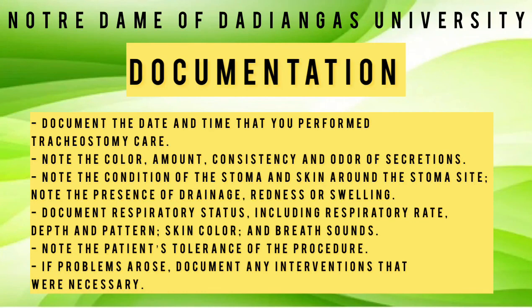For the documentation, document the date and time that you performed tracheostomy care. Note the color, amount, consistency, and odor of secretions. Note the condition of the stoma and skin around the stoma site. Note the presence of drainage, redness, or swelling.